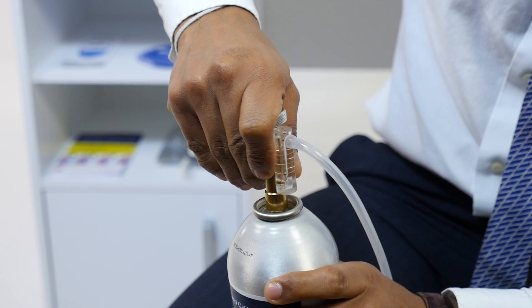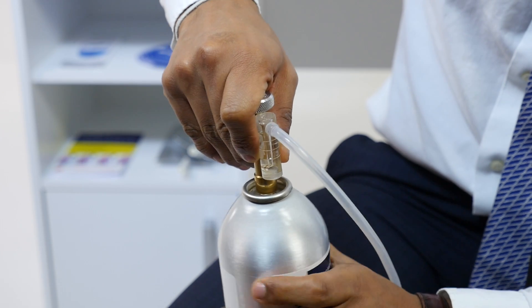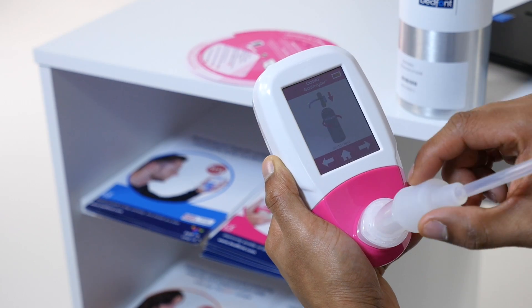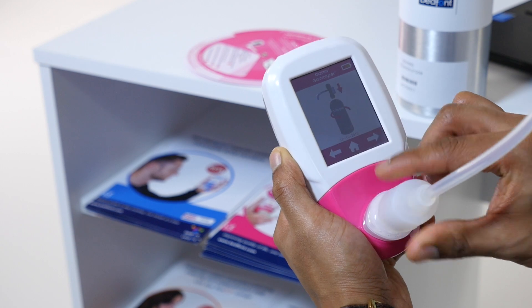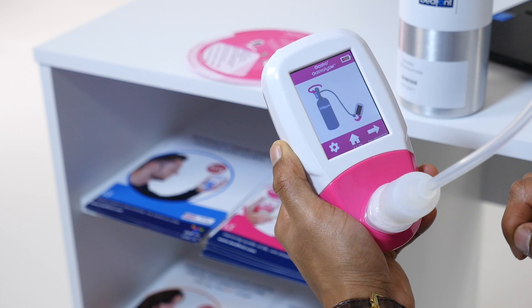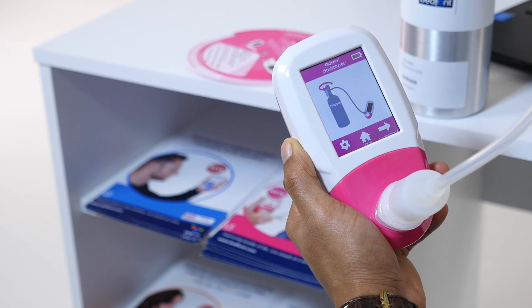To start calibration, click Settings and then the calibration icon. The Gastro Plus will zero automatically while the egg timer is shown. When zeroing has finished, the first step of the calibration process will be shown on screen.